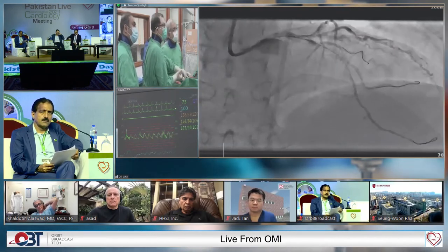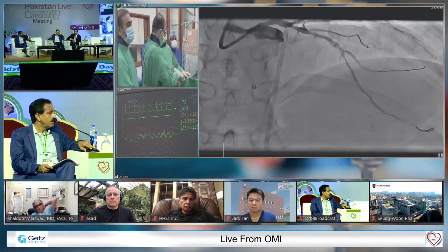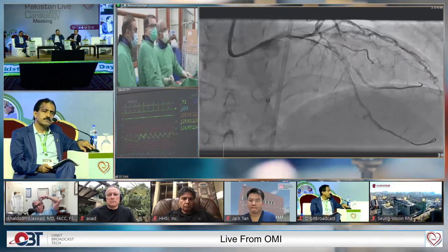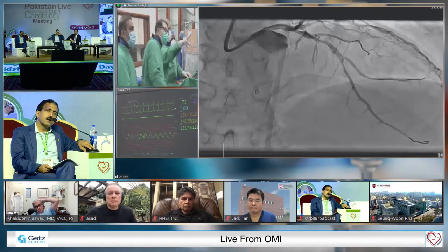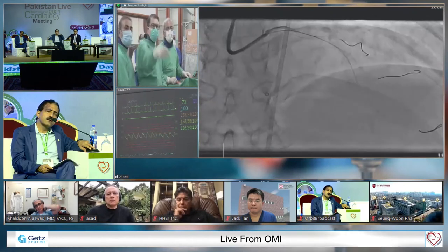So just a couple of things. Do you really need that RCA guide and also that third wire in that upper diag? Probably we can take those out. The upper diag looks small. The more equipment you have, it's going to just increase the chance of thrombus.